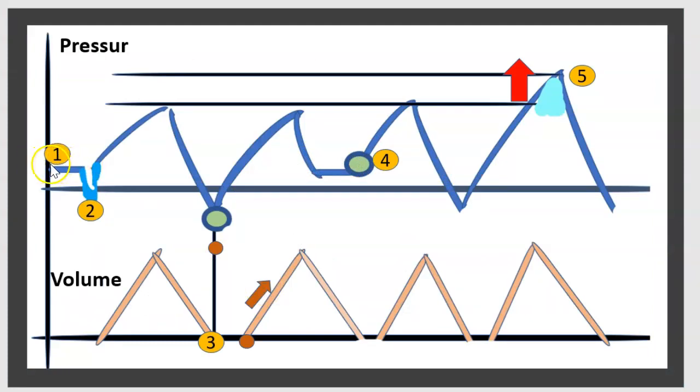Here, PEEP at 5 means alveolar pressure does not fall below 5. Here, negative pressure starts first, then the volume starts to increase. Here, pressure is positive, so the machine triggers the vent. That means the patient is comatose, and the machine is doing the work. Here we are in volume control. If pressure increases too much, an alarm will be triggered.